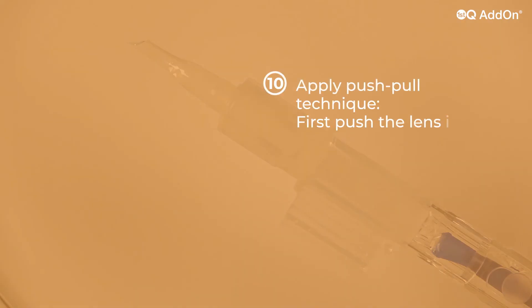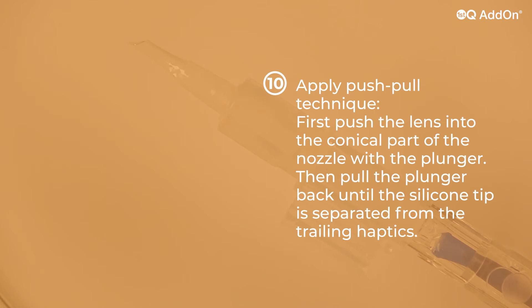Apply the push-pull technique. First, push the lens into the conical part of the nozzle with the plunger. Then, pull the plunger back until the silicone tip is separated from the trailing haptics.